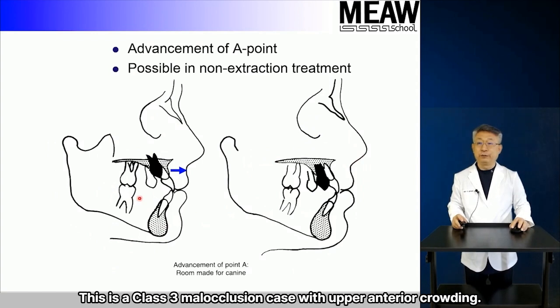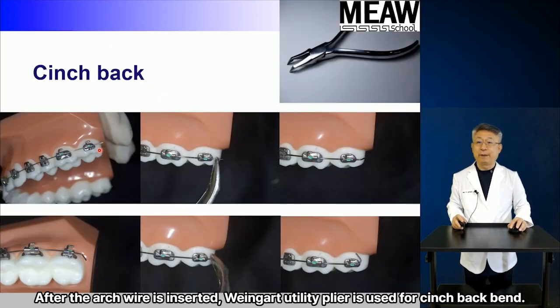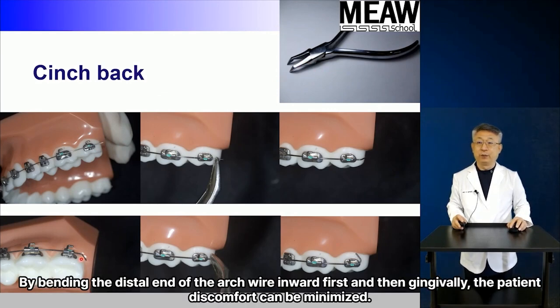This is a Class 3 malocclusion case with upper anterior crowding. If possible, the treatment should induce anterior movement of the A point of maxilla in order to treat with a non-extraction approach. After the arch wire is inserted, Weingart utility plier is used for cinch back bend. By bending the distal end of the arch wire inward first and then gingivally, the patient discomfort can be minimized.